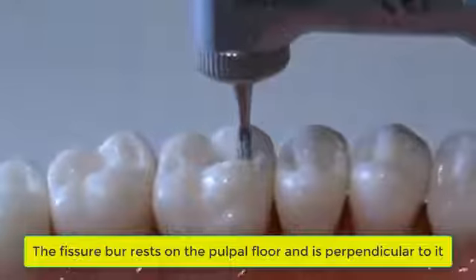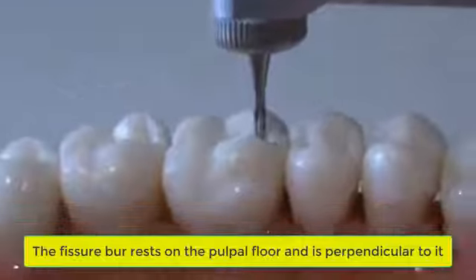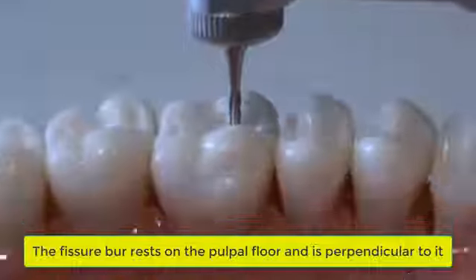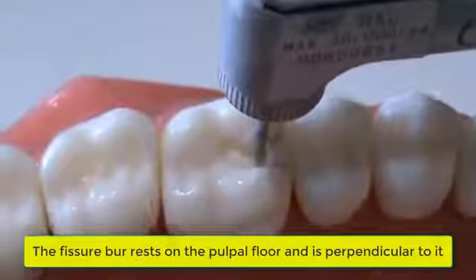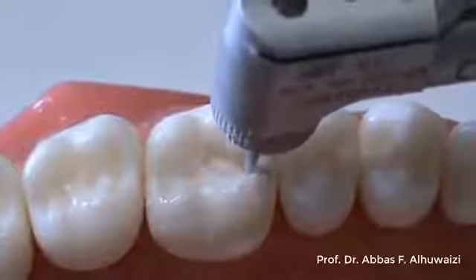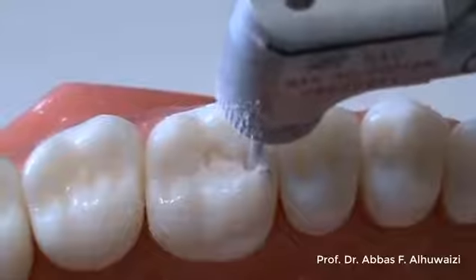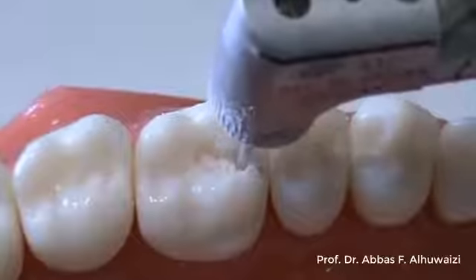This is done by placing the fissure burr at the pulpal floor and moving the handpiece mesially, therefore cutting from the mesial marginal ridge and making it thinner.